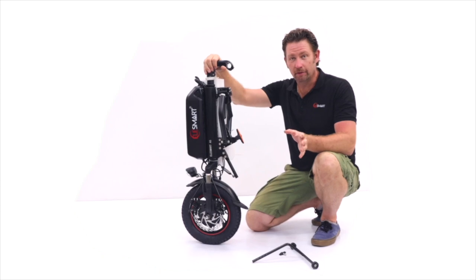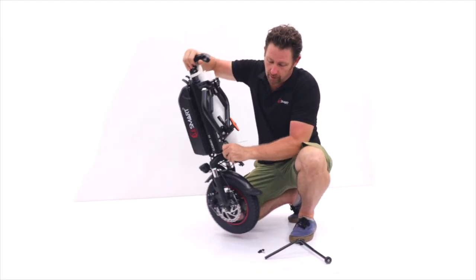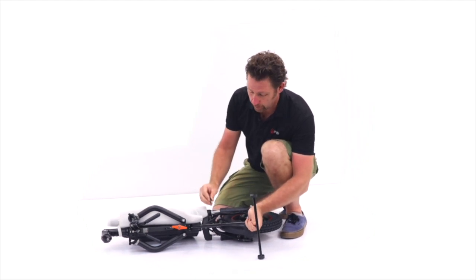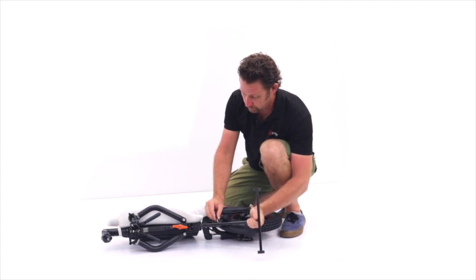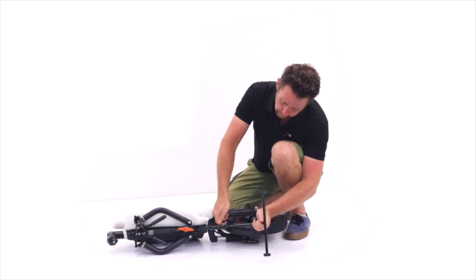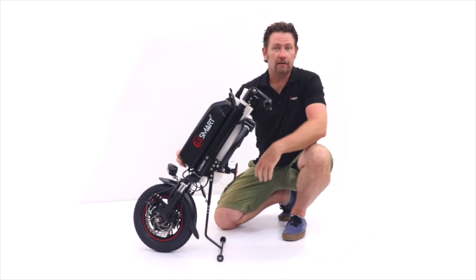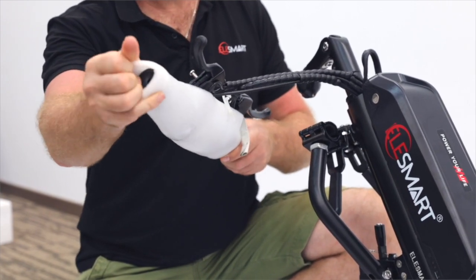So installation is really simple. The first step is to install our support stand. So I want to lay down the whole device first and then insert it into this hole, find an appropriate height, and insert the screw. Then we can stand it back up and continue with the rest of the installation. Connected, we take off the foam.